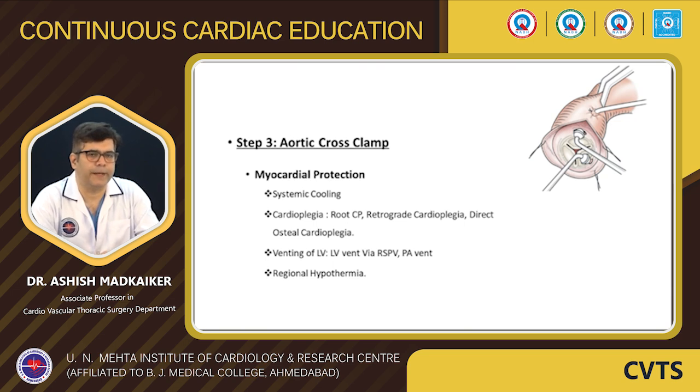So, systemic cooling. We usually cool the patient at around 28 to 30 degrees Celsius for cardiac surgeries, but there are certain institutions, and surgeon preference varies, from cooling the patient to even drifting the temperature to 34 to 32 degrees Celsius for AVR. So again, it varies from surgeon to surgeon and from institutional or unit policies.